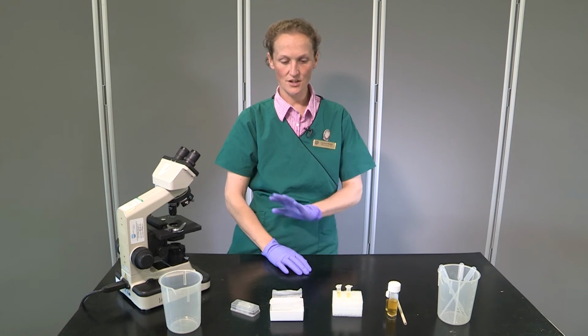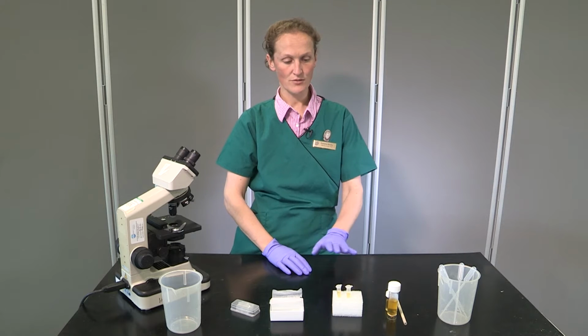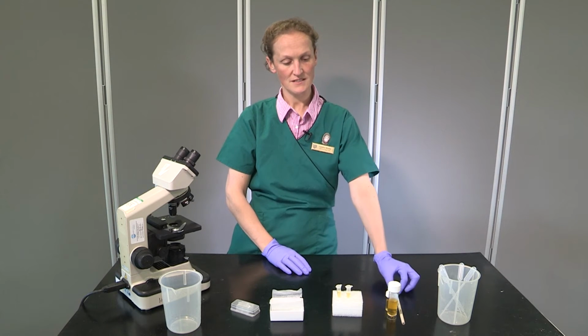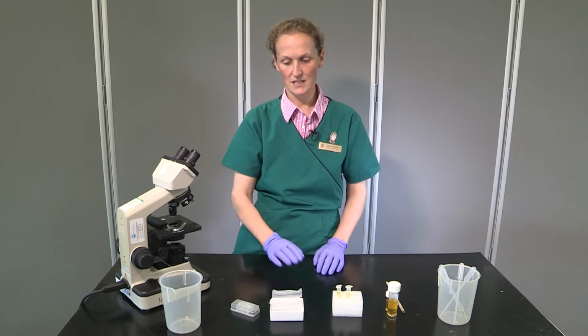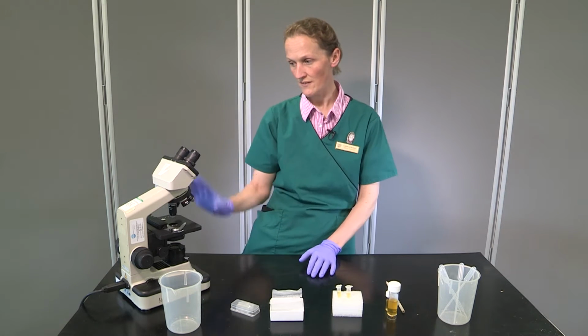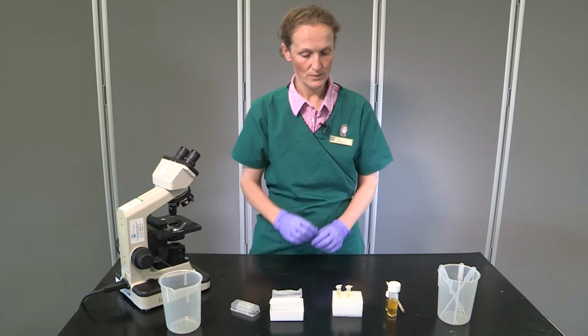So today we're going to go through preparing a slide for urine sediment. In front of me I have the clean pipettes we're going to use, the pencil for labelling the slide, a pre-spun urine sample, microscope slides and cover slips, my waste pot and then my microscope for reviewing the slide afterwards. So we're going to make a start.